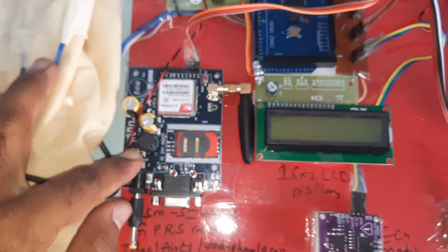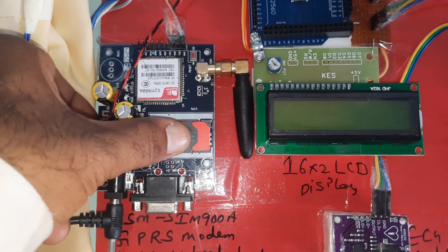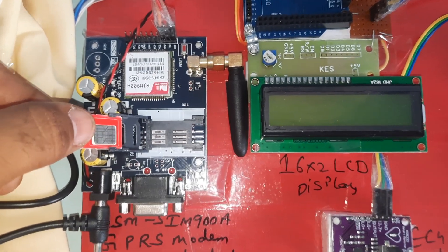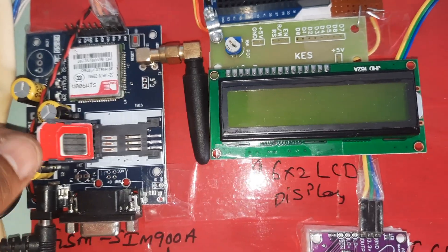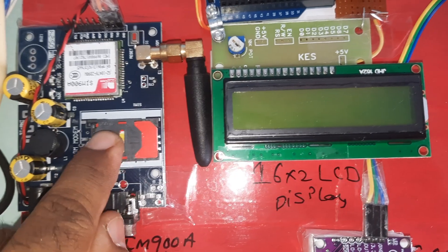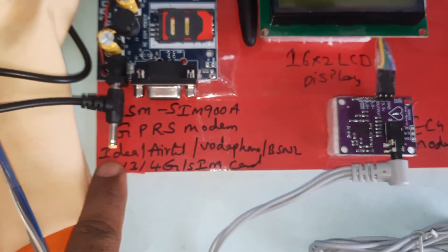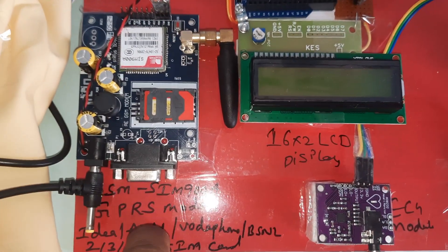Here is the SIM900A module — it is a lock/unlock type. Press it and insert the SIM card slowly, then lock it. You can use Idea, Airtel, Vodafone, or BSNL 2G, 3G, or 4G SIM cards with SMS balance, main balance, and internet balance.